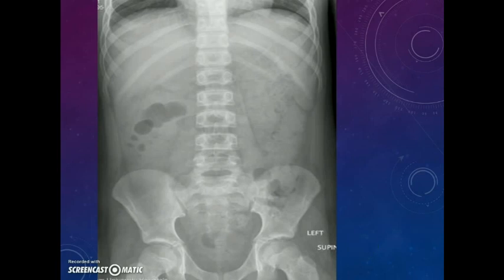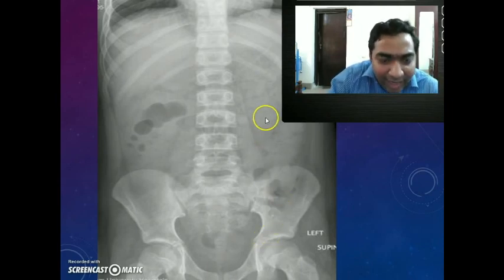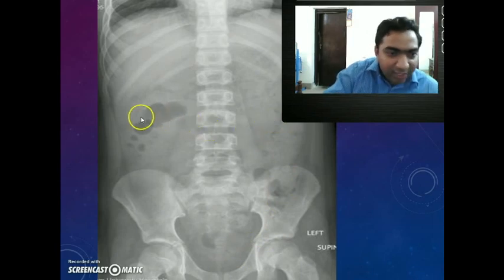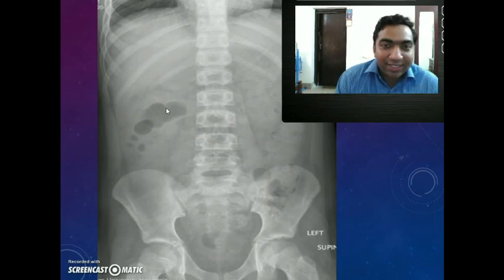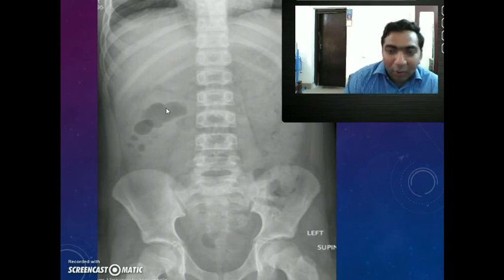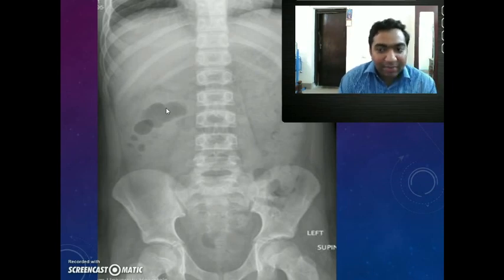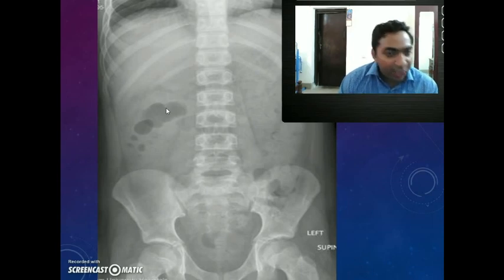Initially when we see an abdominal X-ray erect, we have a lot of doubts — like, is this granularity important? Is this air shadow important? But before looking into all those, always check the name, age, confirm the view, and go in an orderly manner. Look for the bony skeleton initially, then look for the soft tissue shadows, and finally the air shadows.